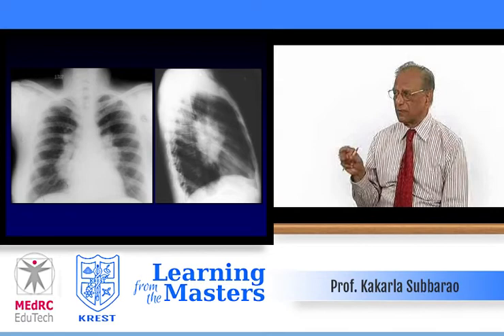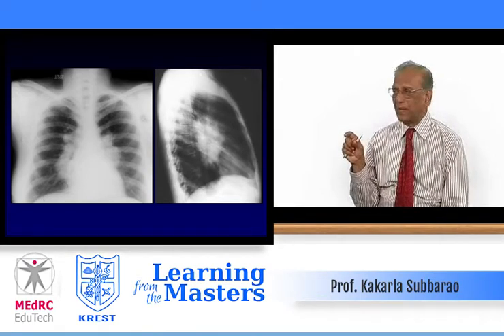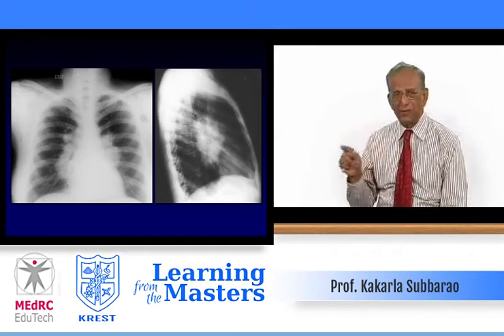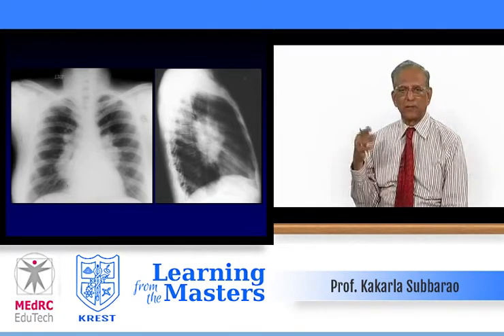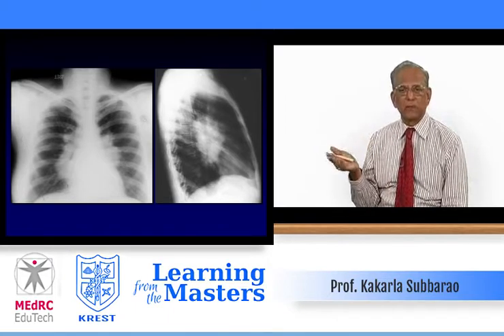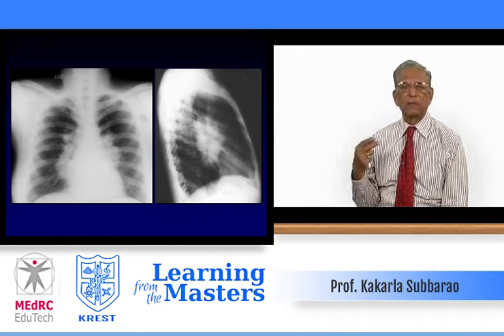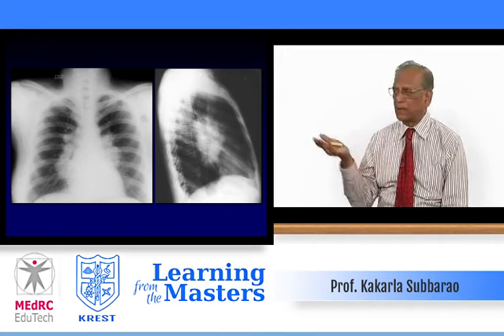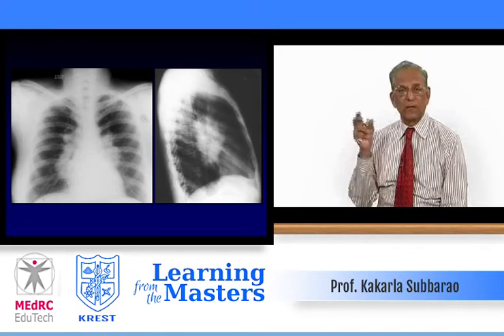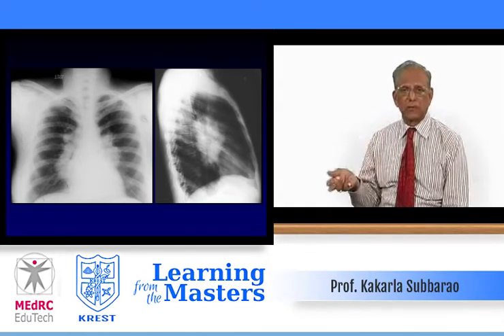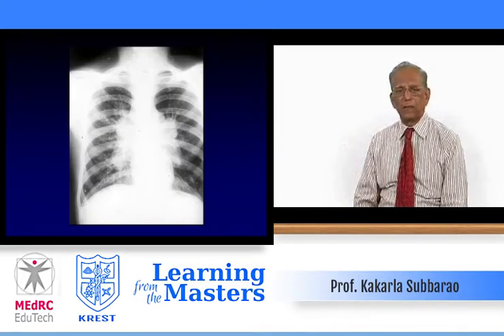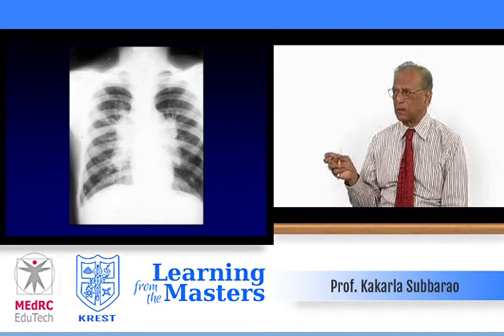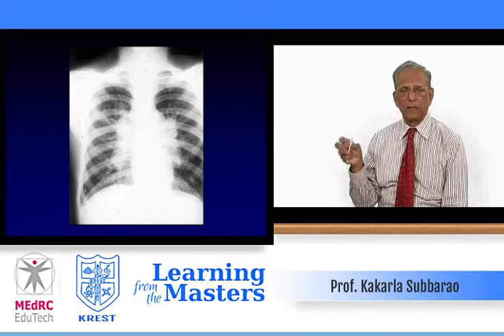Whereas here, if you look at the nodes, they are discrete in the hilum, and on the lateral view they are surrounding the hilum — this is typical of sarcoidosis. Sarcoidosis is rare particularly in children, but occasionally you may get a 15–16 year old student who comes with a little cough and mild fever. Look at the chest: there are nodes — don't immediately jump to tuberculosis or lymphoma. Another case of sarcoidosis shows typical potato-like nodes in both hila and right paratracheal region.